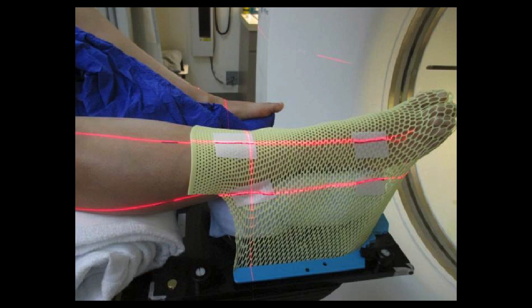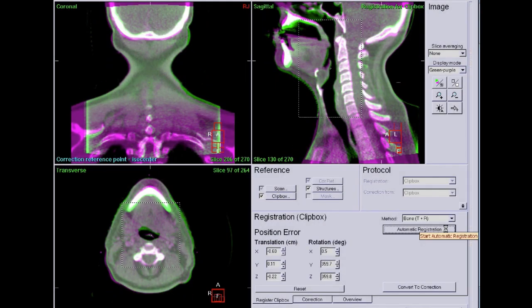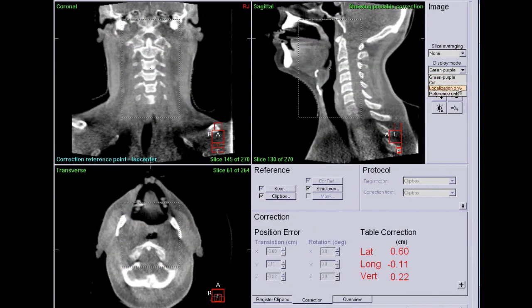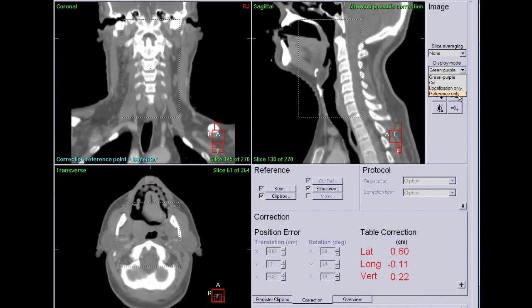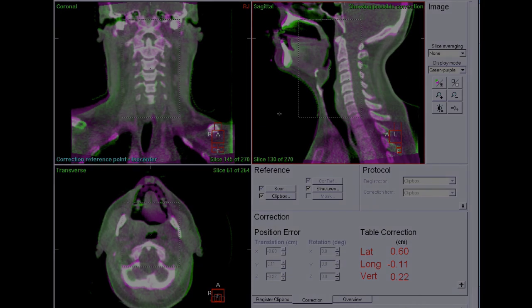Part of the reason I'm mentioning this so much is that it's important when you go to treatment, even with the use of image guidance, you can't completely control the position of everything. You'll see here the patient's neck is flexing a bit, and so if you align one part of the anatomy, another part will be misaligned, even if you have very good image registration.